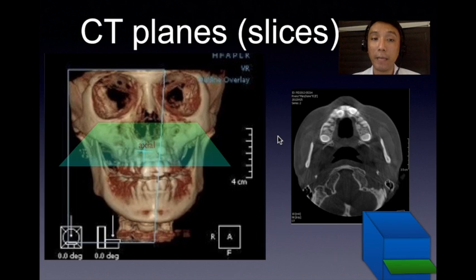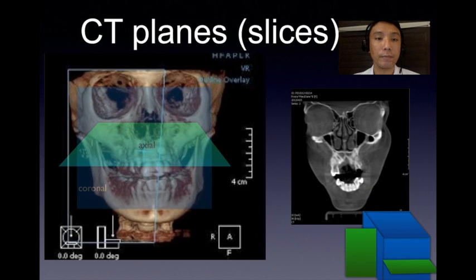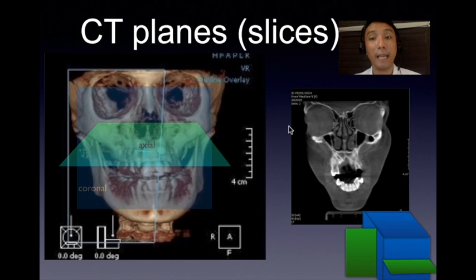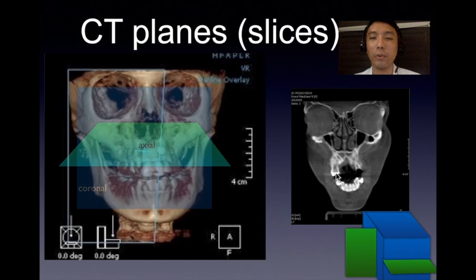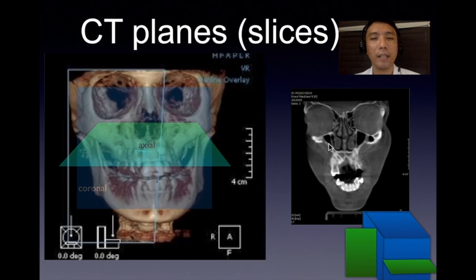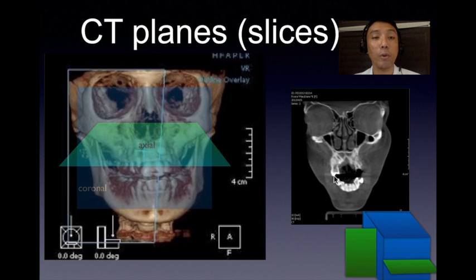Other CT scan planes based on anatomical planes would be available, such as the coronal view. On your coronal view, you see a cut section or a slice from the coronal plane. Depending on where you are, you will see anatomical structures. This is somewhere towards the premolar area — that is why you don't see the molars, why you see the small entrance of your maxillary sinus, a portion of the zygoma, and why you do not see the ramus.